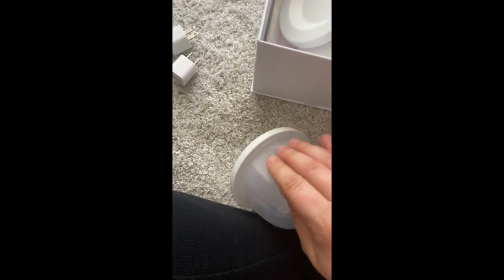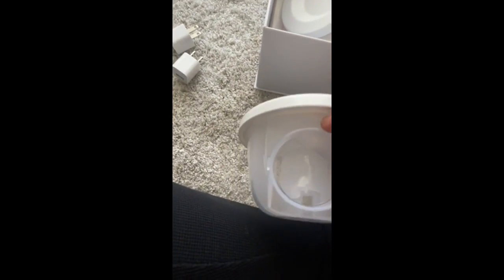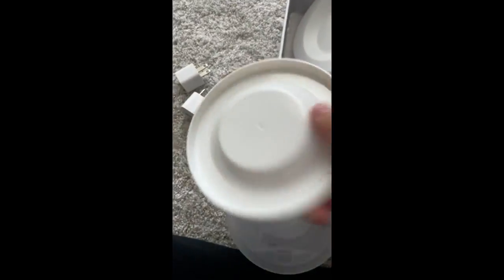So let me take this off. So when you remove the top of this, you're left with this, and then this closes up, and then you put the stopper in here, and that's when you go to pour the milk. You're pouring the milk, it comes out of this little spout. So let me just take this part. This comes right off, which is nice. And then this is what you have.